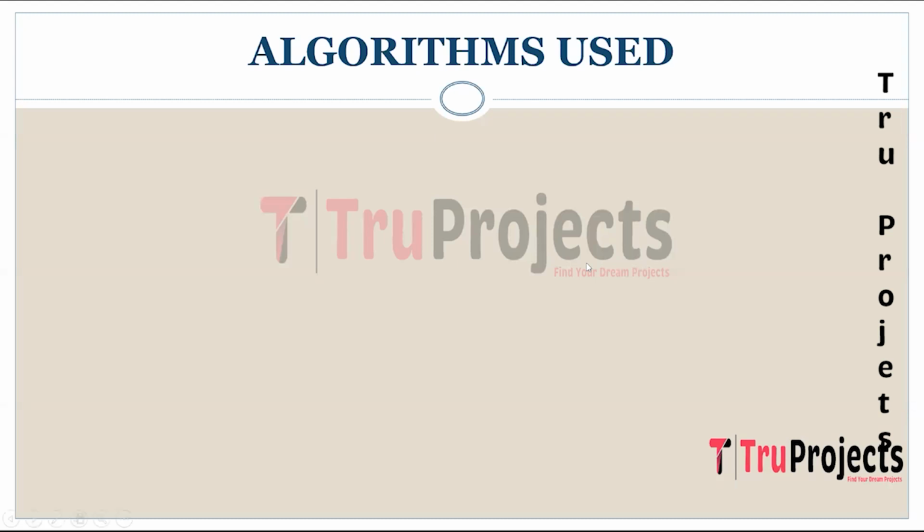Algorithms used in this project are ResNet 101. It is a deep convolutional neural network architecture that is part of the ResNet family. It is characterized by its deep structure with 101 weight layers. The core idea behind ResNet is to use residual blocks which contain skip connections to allow the network to learn residual functions. This mitigates the vanishing gradient problem, enabling the training of very deep networks. ResNet 101 is used in image classification tasks including medical image analysis, due to its ability to learn intricate features and patterns from complex images.